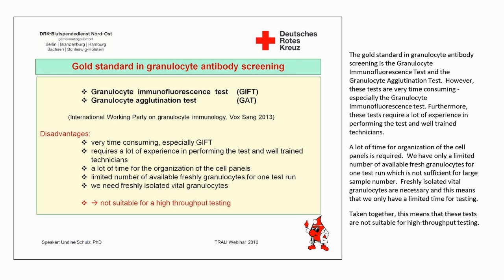However, these tests are very time-consuming, especially the granulocyte immune fluorescence test. Furthermore, these tests require a lot of experience in performing the tests and well-trained technicians. A lot of time for organization of the accurate cell panels is required. We have only a limited number of available fresh granulocytes for one test run. It is not sufficient for a large sample number.